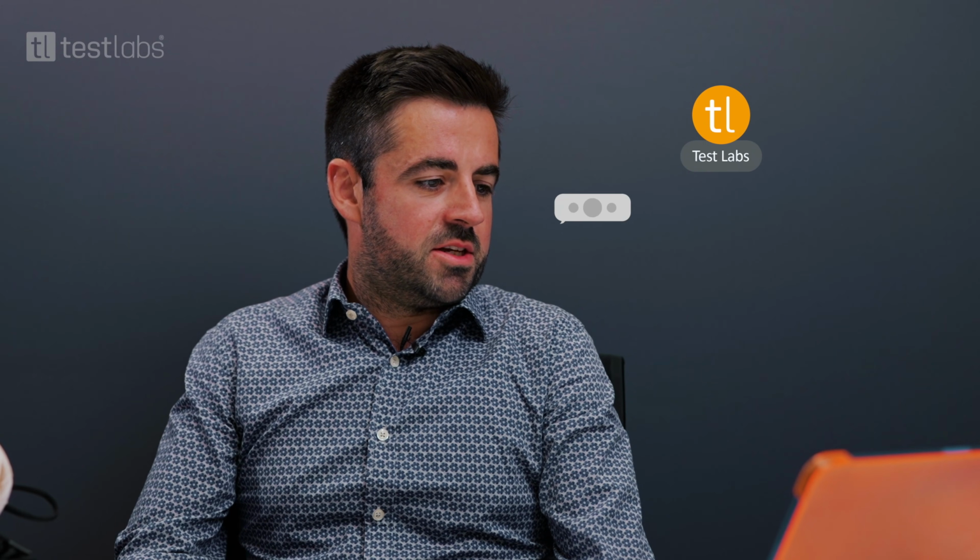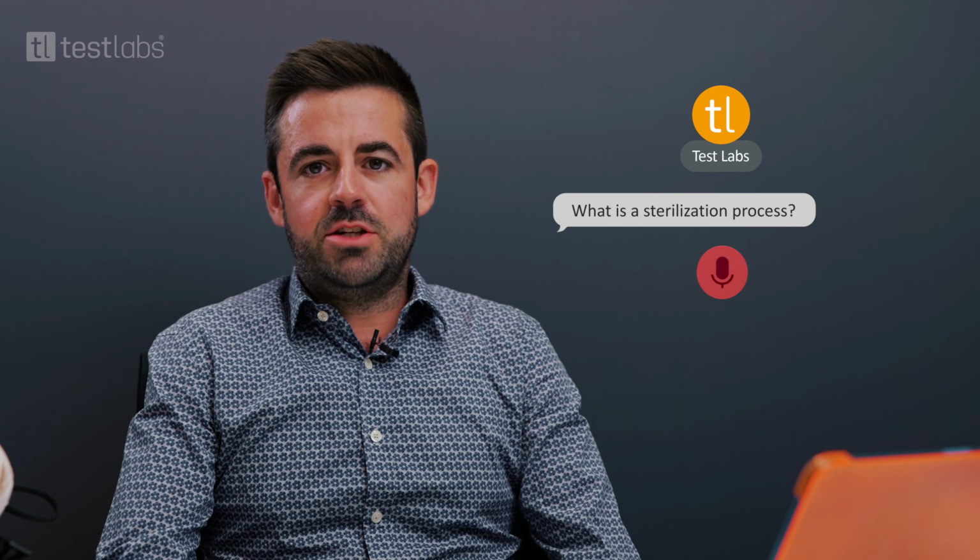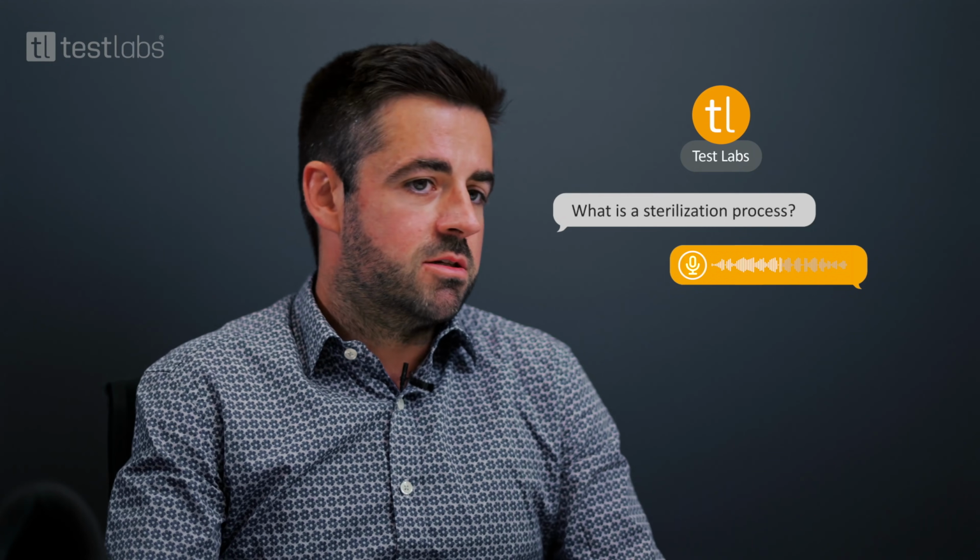What is a sterilization process? In general, sterilization refers to achieving a sterility assurance level, which is commonly referred to as 10 to the minus 6, inactivation of microorganisms. There are different methods to achieve sterility: physical processes and chemical processes. My expertise is more in VH2O2 sterilization, which is a chemical sterilization method.